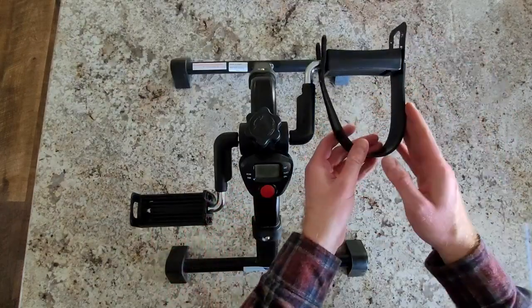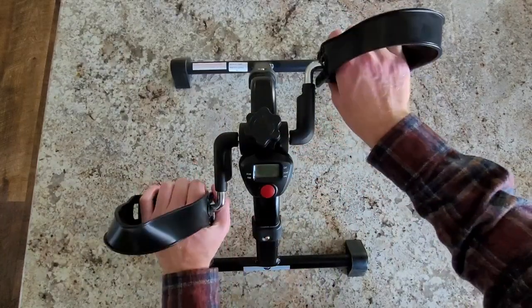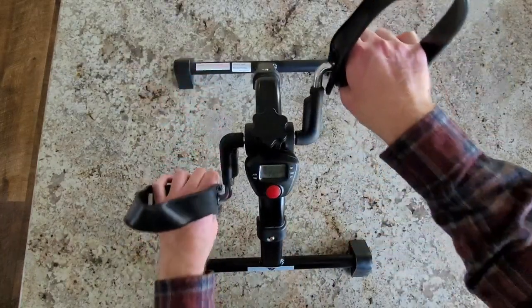This is how it works. There are these straps here that you can just put your foot under, or hold on with your hands, as I'm doing here. And then you just start pedaling away like this.